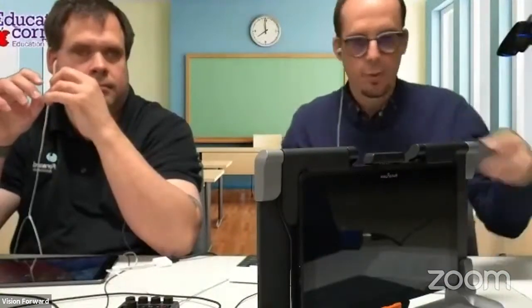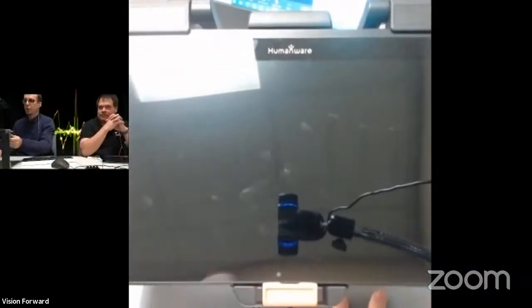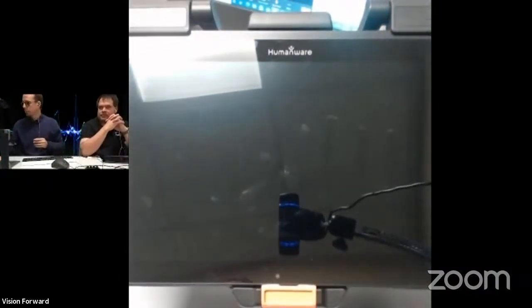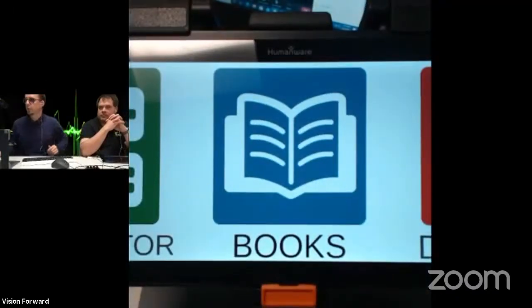Now I'm going to try and put this under the webcam so we can take a look at it. If you would bear with me a second here. I'm going to fold out the screen, and I'll switch to the webcam. We are running out of room quite badly here. Okay, so let's go to the webcam. Okay, now, at the moment, it's going to look strange because it's got a lot of reflections on it, but I'm hoping when we turn on the screen here, that should become somewhat clearer.